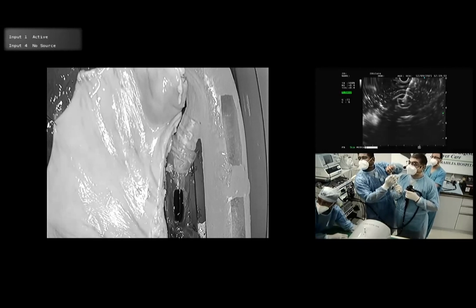So see, problems. We all have to learn these problems. Be patient. Okay, it is not coming, right? Well, see, there is a narrowing there. So it will not go beyond until it enters from there inside. Otherwise, it will go on coiling there just above the papilla. Right? No, it is not going to happen. Withdraw will not work, right? It will not. So again it is stuck.